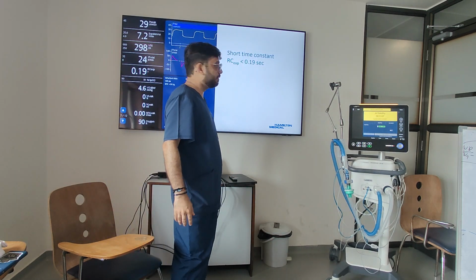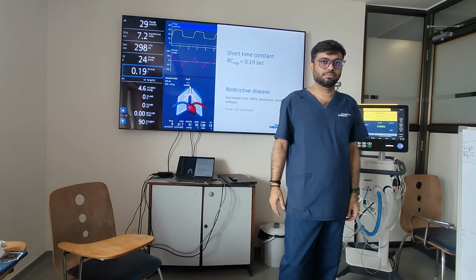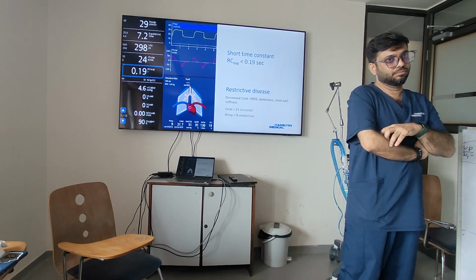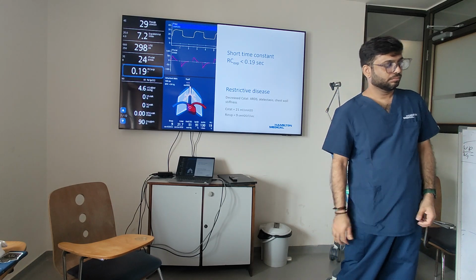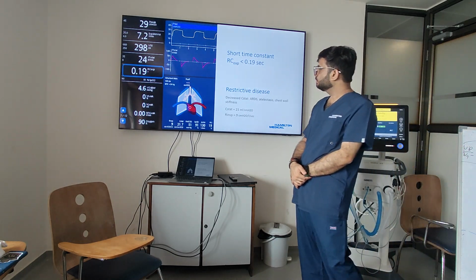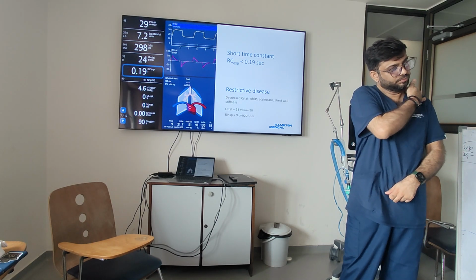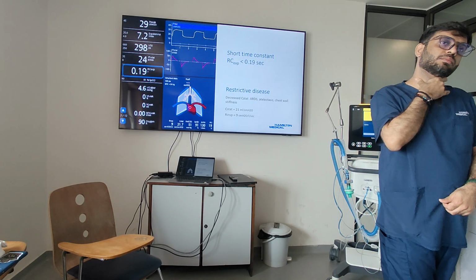Now here I'll compare. Sometimes they show an I:E ratio of 1:5. It will do that on its own. So he'll explain. Normally in a ventilator you are setting the I:E ratio, 1:2. You are setting it on the ventilator. The beauty of this ventilator is the pattern of breathing. This I:E ratio is the pattern of breathing: how much inspiration, how much expiration, how much force, how much work, isn't it? This pattern is actually decided by the ventilator based on this complex Otis and Mead formula. So it may go from 1.1:1 to 1:3 to 1:2 to 1:2.5. It will do that. And sir, it is also affecting ETCO2.